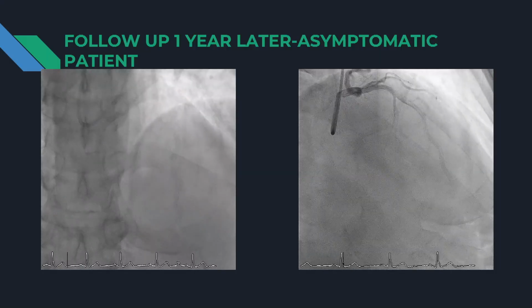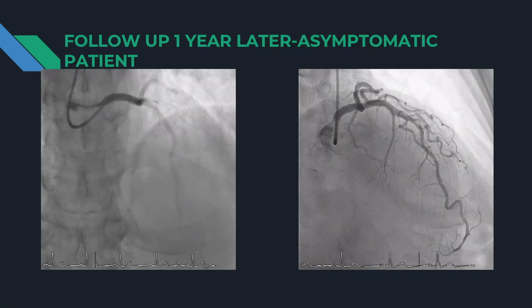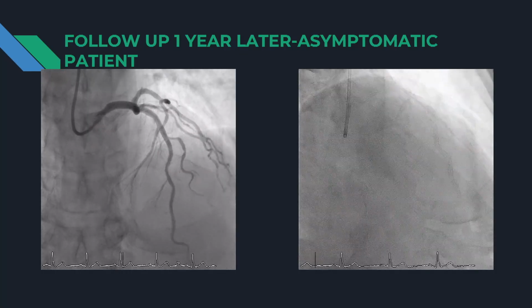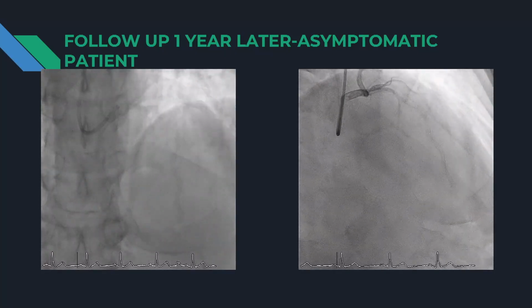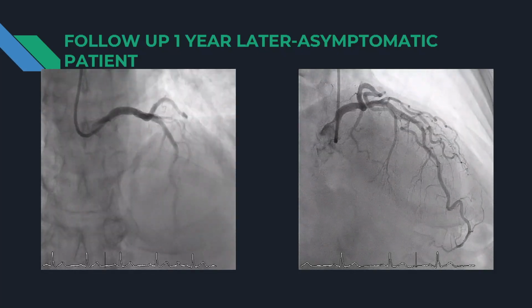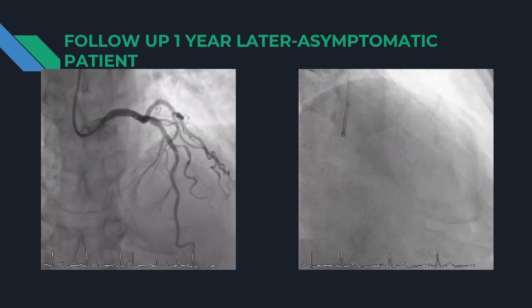How do you judge this angiographically? Is it what you expected? It seems that the lumen is becoming a little bit smaller where you have the flexing point. I think it's intramyocardial. It's almost a bridge over there. So the stent is a bit undersized, and I don't think it's stent stenosis. It's stent underexpansion. But if you are disconnecting the structure where you have a flexing point, do you think that it is anyway good or can make some?